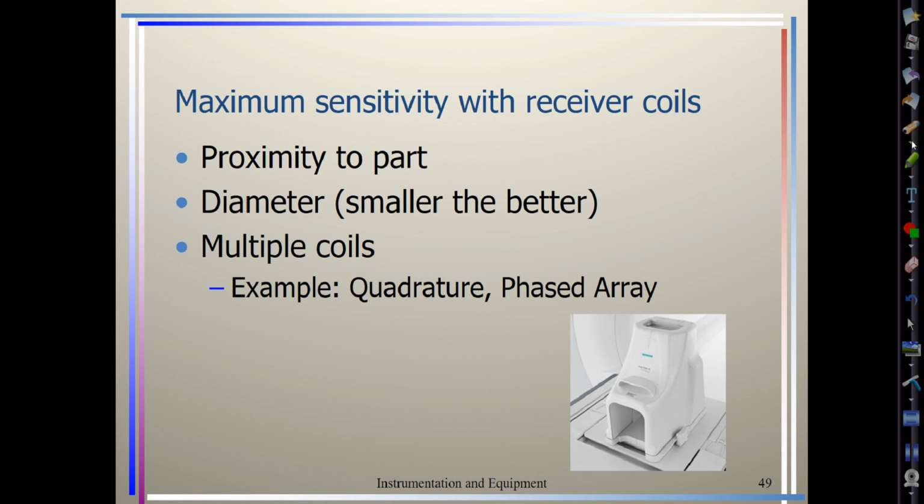And a rule of thumb is, let's say you have a receiving coil, one of these flex receiving coils, and we're trying to measure the width of this receiving coil, and it comes to about 3 inches. How much in terms of depth do you think that receiving coil collects into the patient's body? It's only about half the diameter of that receiving coil.